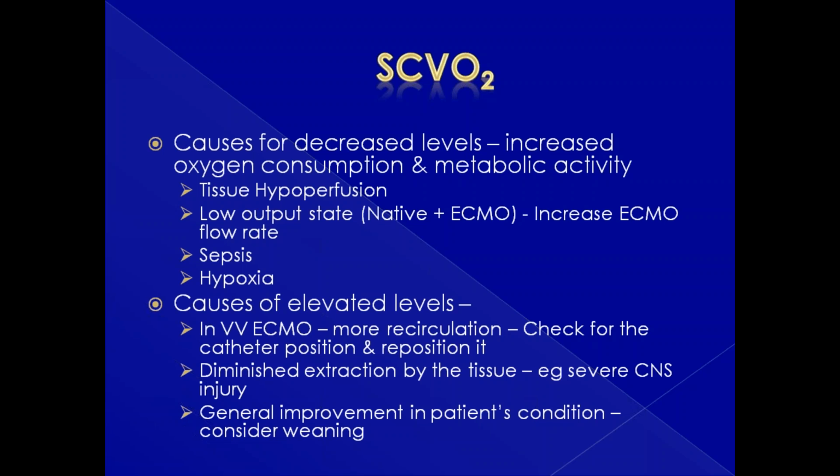Recirculation is close to negligible with the Avalon cannula, but at the moment it is not available in India. We have done a few at KIMS on a compassionate basis. We were given those cannulae from the US, but we are trying to make sure the Avalon cannula becomes available in India and other southeastern countries. Dr. Joseph Schwanberger is the man who devised the Avalon cannula. I am in continuous touch with him to make sure we also will get the Avalon cannula in future.